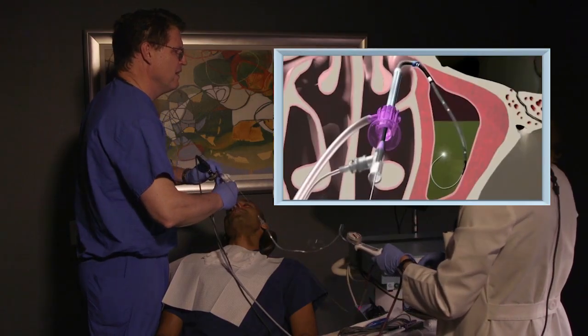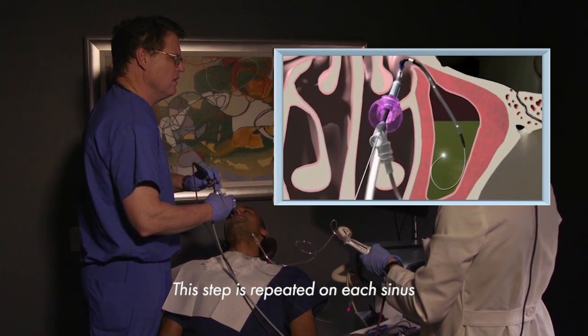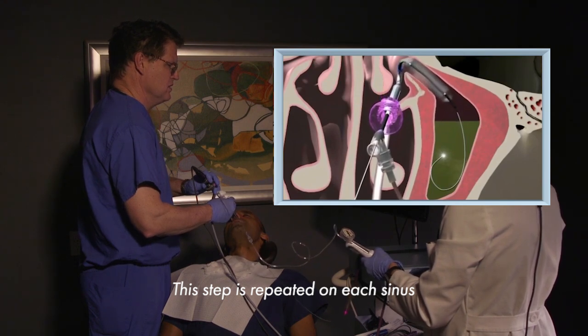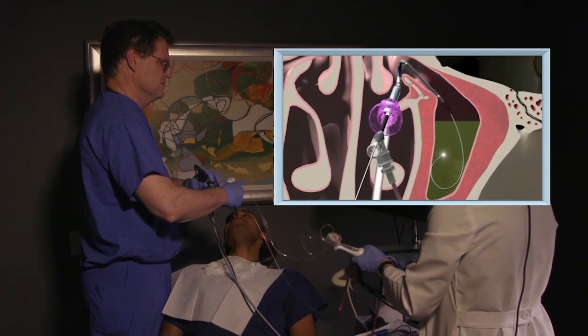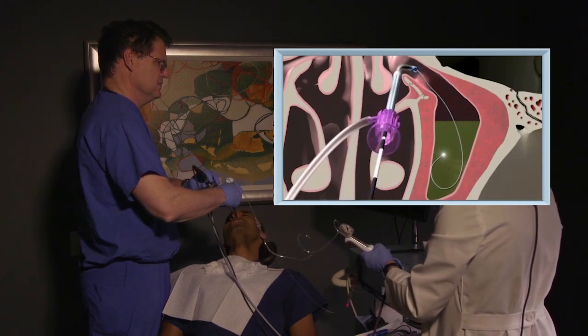Now we're going towards the cheek sinus on my left-hand side, just trying to get this natural sinus opening expanded. A little bit of pressure here — not bad, and a little bit more. I can feel it kind of in my upper teeth a little bit.